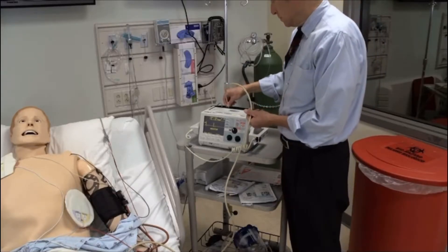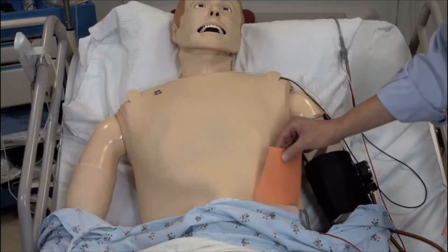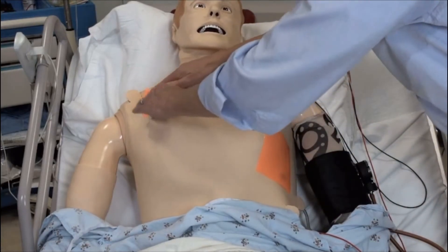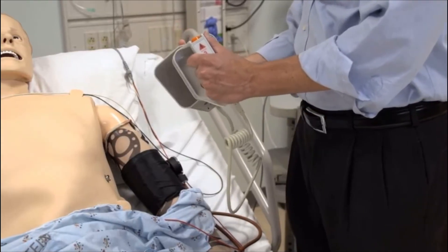Attach the defibrillation cables from the pads to the defibrillator. If using paddles, you must place conducting material between the paddles and the chest to avoid skin burns. Use either a conducting gel sheet or liquid gel that you place on the paddles.